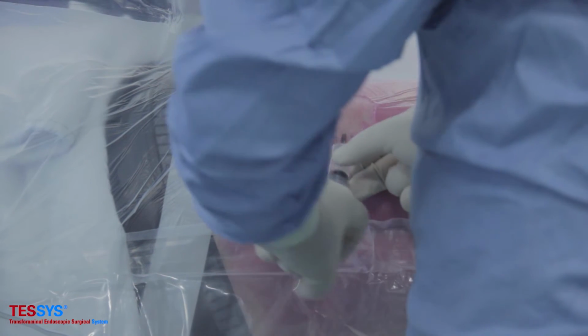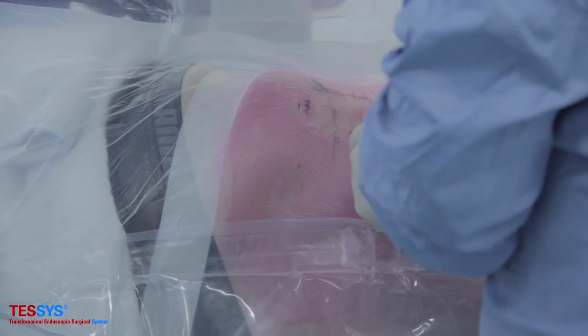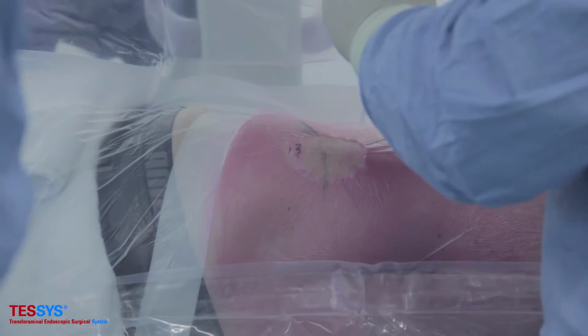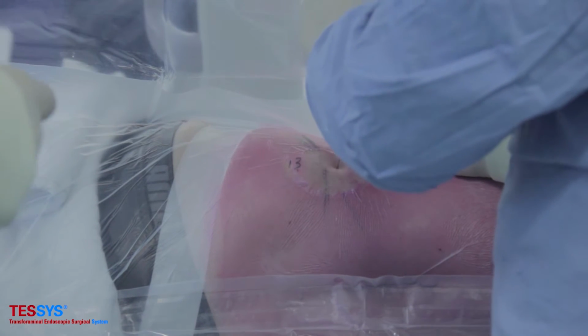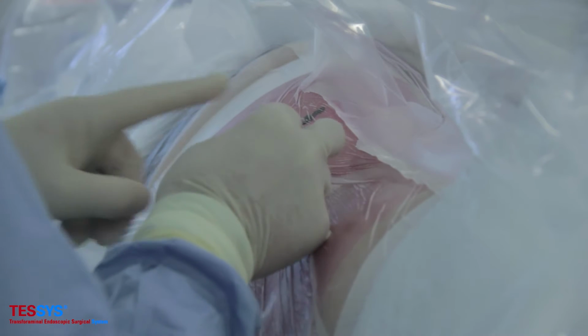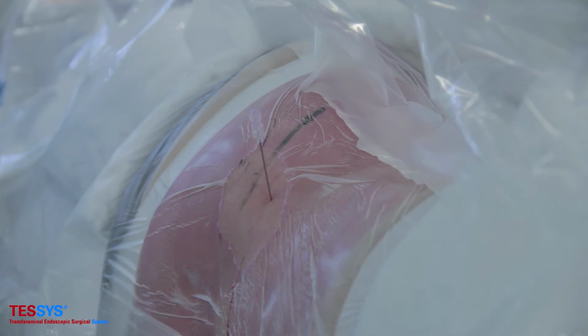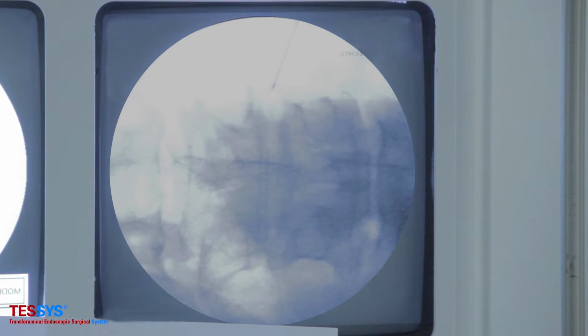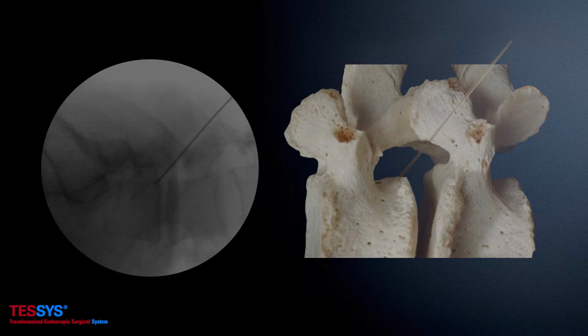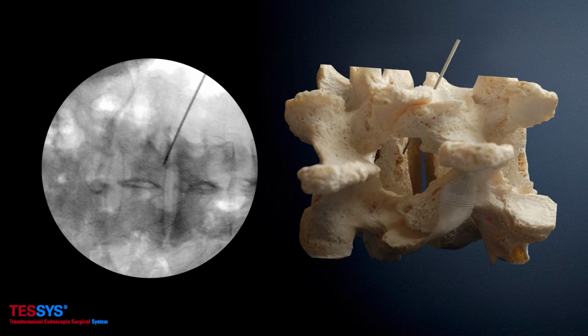A small piece of the sterile drape is removed to prevent bringing pieces of plastic into the spinal canal with a reamer later on. The skin is anesthetized. Under image intensifier, the direction of the introduction of the needle is estimated over the isthmus L4-L5 to the upper backside of the fifth vertebral body in lateral position and just medial of the medial interpedicular line in AP view.